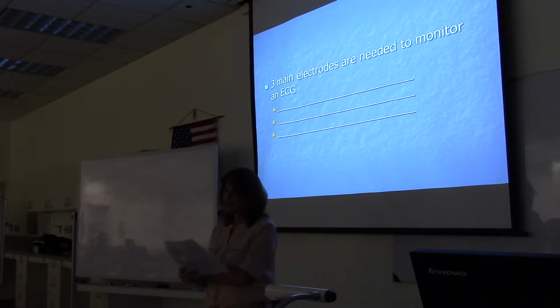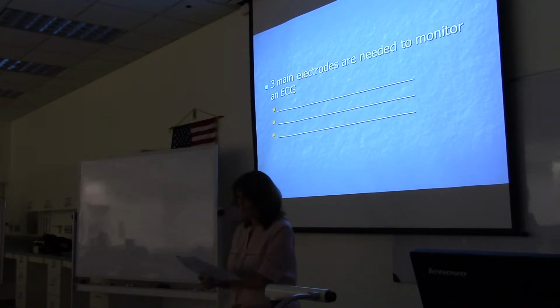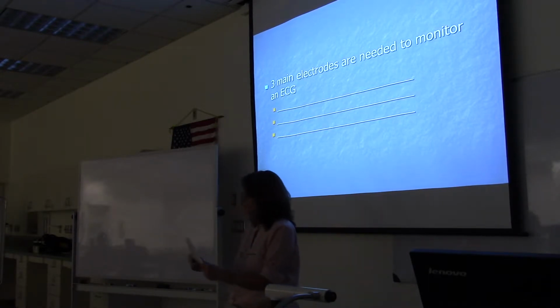And the third line, write down ground, the ground wire. Place on left arm or preferably under the left mid clavicle. So left arm or left mid clavicle.